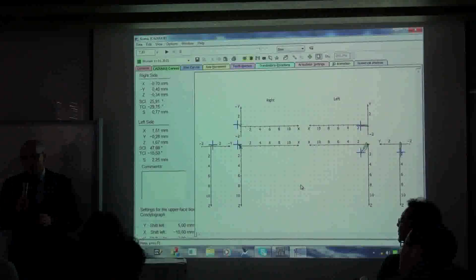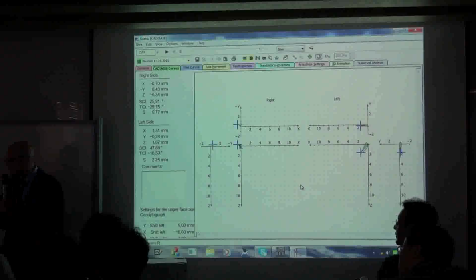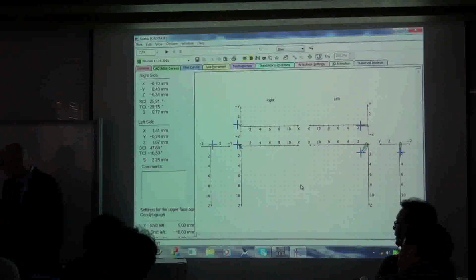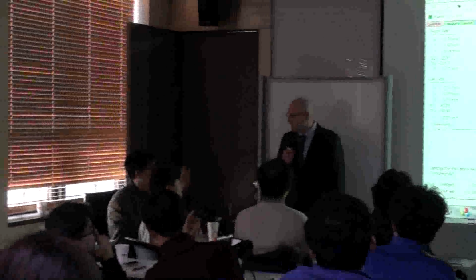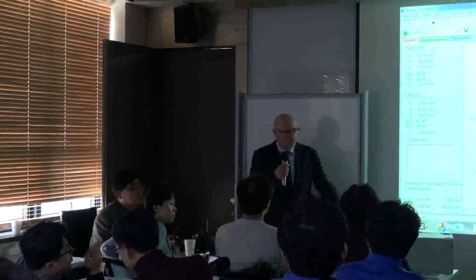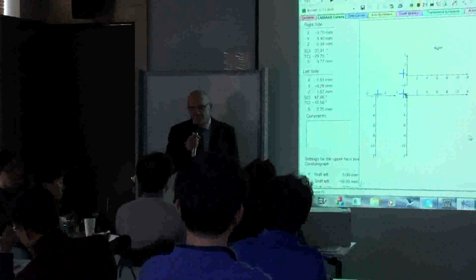RP splint and CR splint, very close together. It's just the name. Okay? RP is almost the same as CR splint. Yes. Again, RP position, splint in RP position is RP splint. Reference position splint. Yeah. This position. Stabilized joint in this position. Okay?